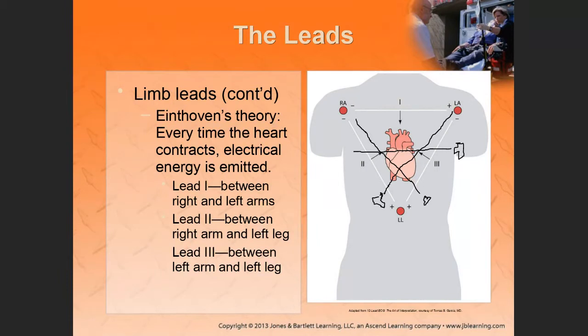And basically, what occurs with a 12-lead ECG, let me zoom out back to the best fit. What happens with a 12-lead ECG is the 3 limb leads are augmented to form 3 more leads.